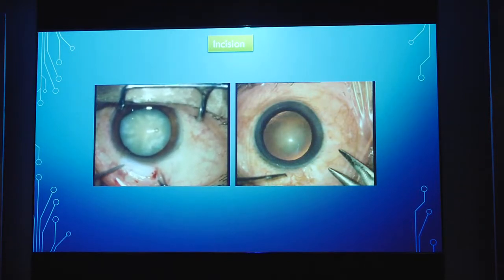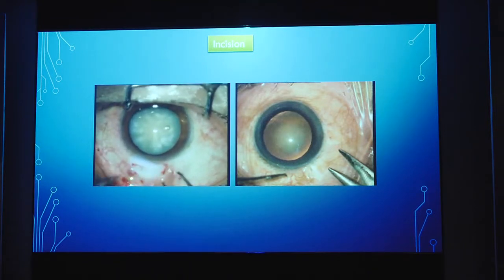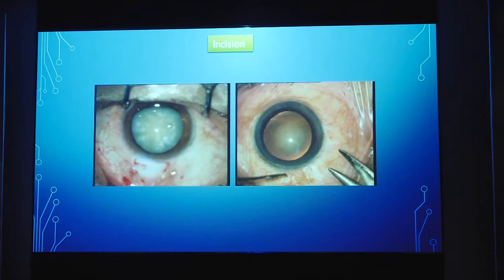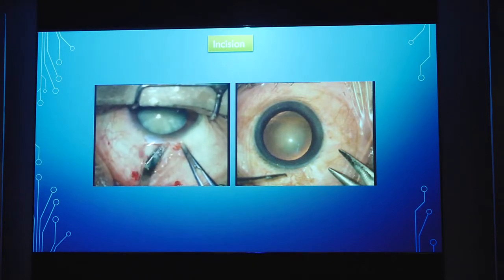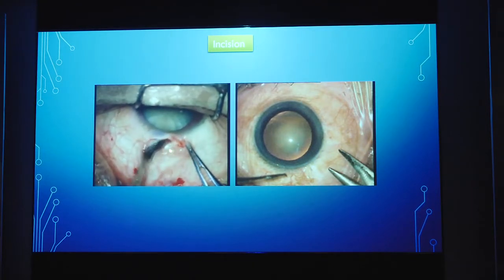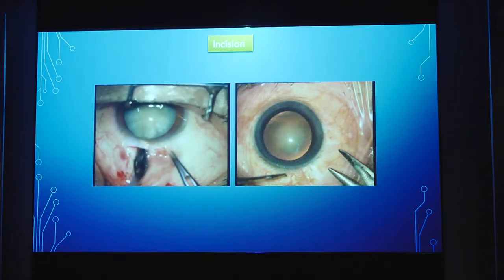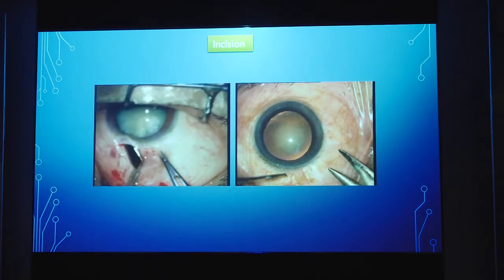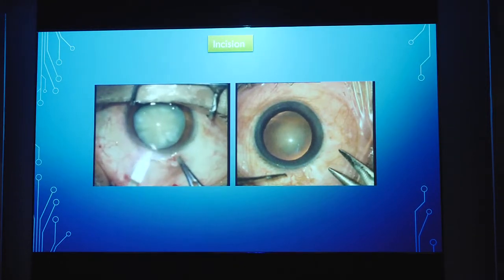As you can see over here, I'm a left-handed surgeon. This is a mature cataract, a straight line and back cuts, which is the initial first part of the incision, that is the groove on the sclera. We use proper blades. These are very reasonably priced now in India. Indian blades are very good. One set costs you about 175 rupees, and it is use and throw. So as you can see, this is the pocket.